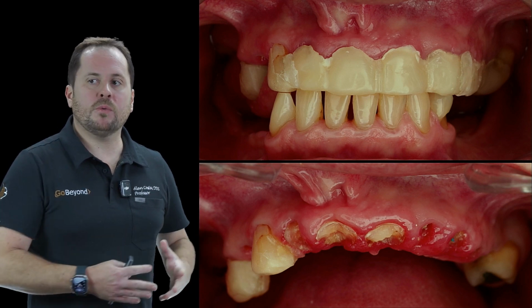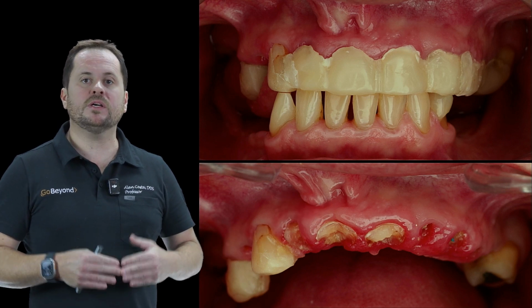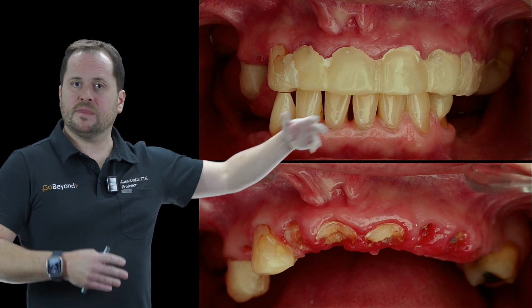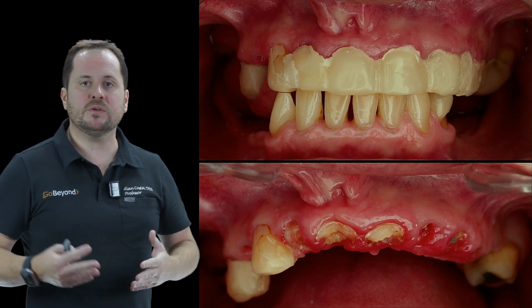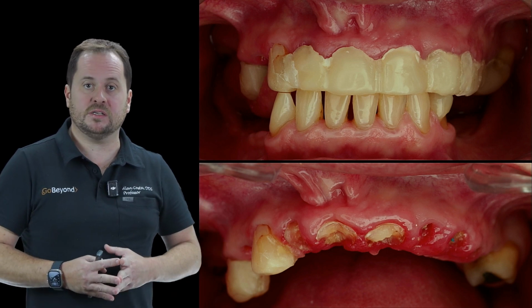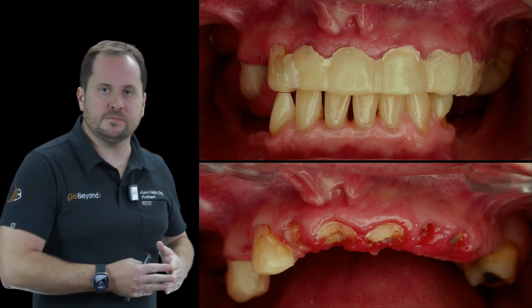So what is the proper way for us to work with this patient? It is to achieve an environmental adjustment. The patient presented with this temporary prosthesis that you can see here in this area. It was all inadequately adapted, patched up with resins and everything else that was available. So we necessarily need to work with what we call environmental adaptation in this patient if we want to achieve excellence in the result of a PF1 prosthesis.